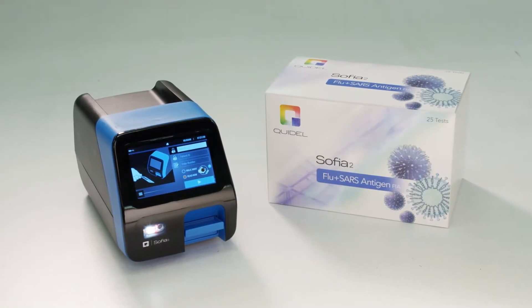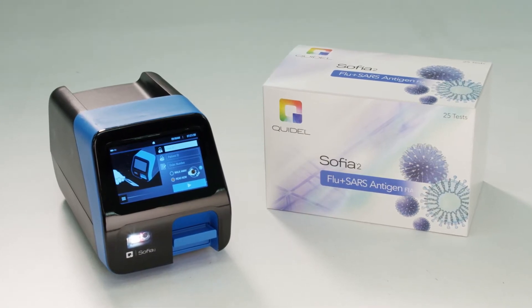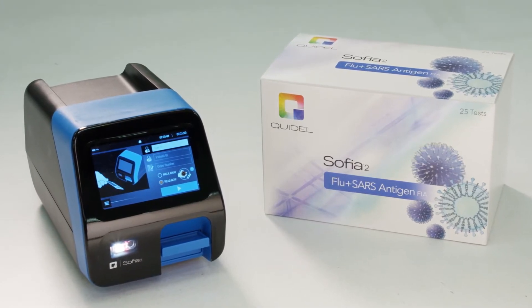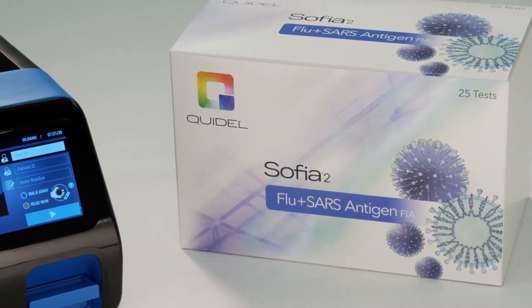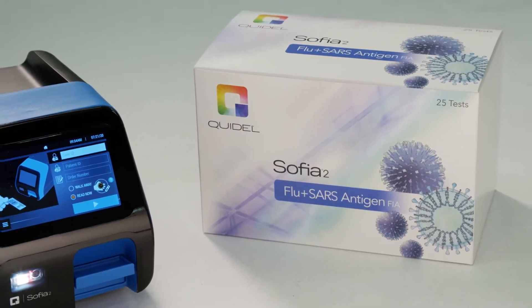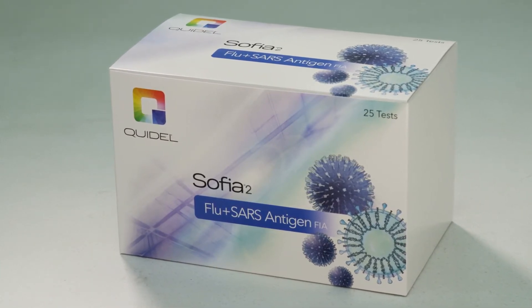Performing testing with SOFIA2 Flu Plus SARS Antigen FIA test kits is simple and flexible. SOFIA2's dual work modes adjust to your volume fluctuations and allow for significant throughput and batching of samples in read now mode. This module will provide users guidance on how to prepare patient specimens to produce results on SOFIA2 from nasal or nasopharyngeal swabs. The assay used in this demonstration is the SOFIA2 Flu Plus SARS Antigen FIA.